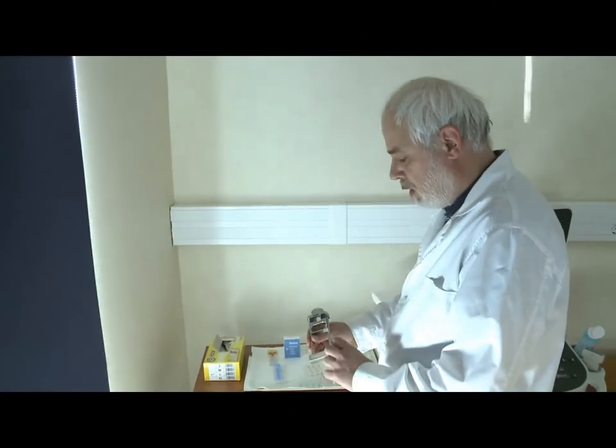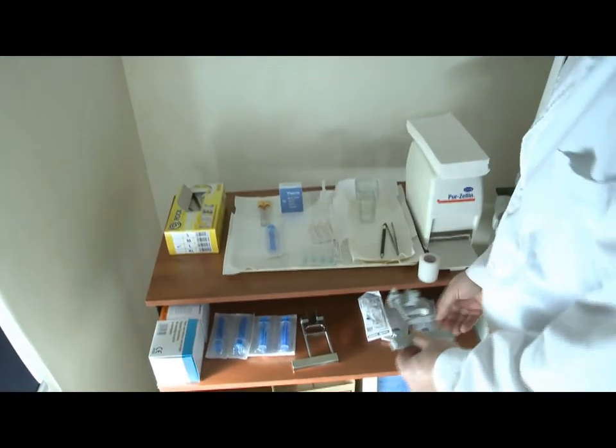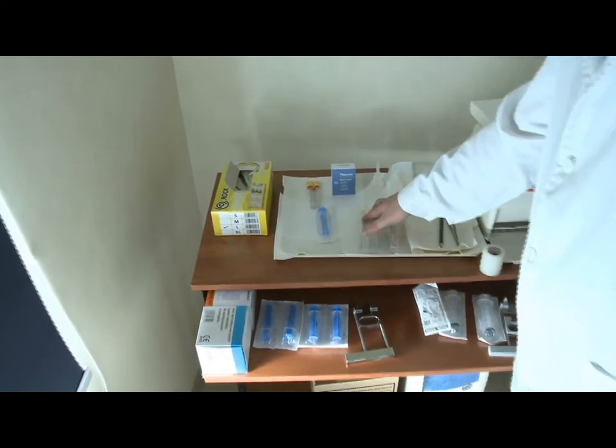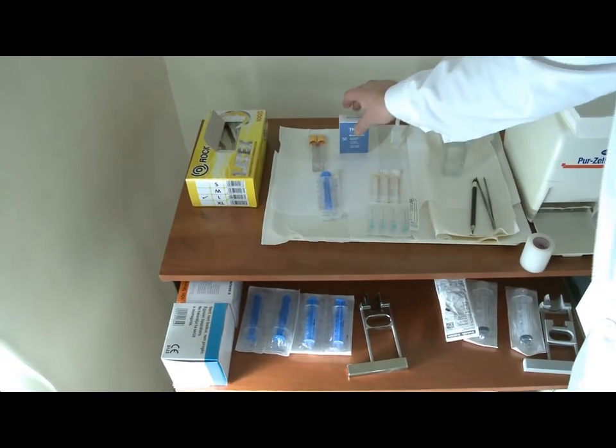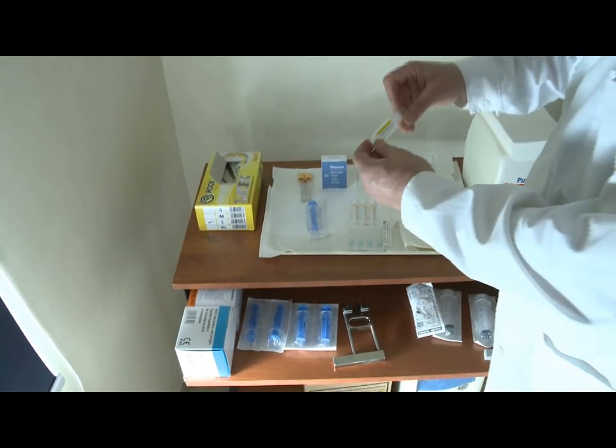Biopsy pistol with the corresponding syringe. The larger 20 ml caliber pistol and the corresponding syringe. Needles, slides, cuvette filled with alcohol, and the normal saline.